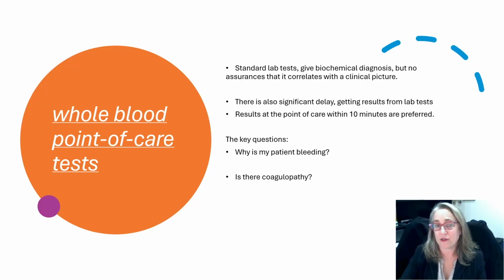Standard lab tests, as you know, give a biochemical diagnosis, but there's no assurance that it correlates with a clinical picture. The lab tests were not designed to predict coagulopathy or not. They're also not done at the point of care. There's a significant delay getting lab tests back, and when they're done at the point of care, you can get a result in 10 minutes or so.